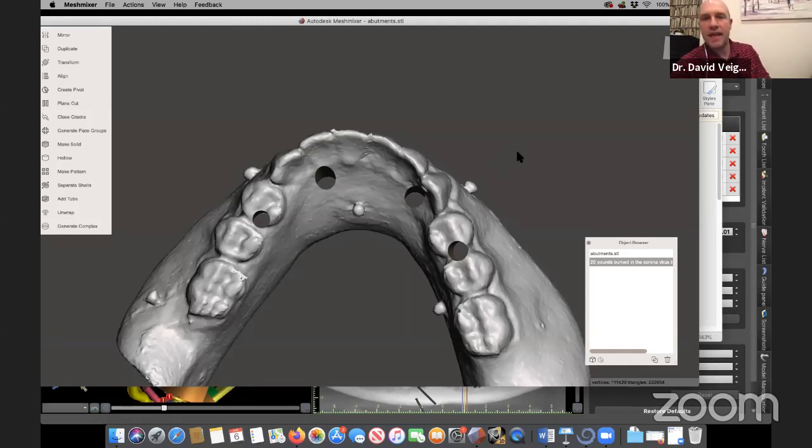Okay, is there any benefit to a pre-scan reline of an approved removable restoration with a radiopaque material such as Blue Mousse fixed with Fit Checker set retardant? So that's from Paul Springs.